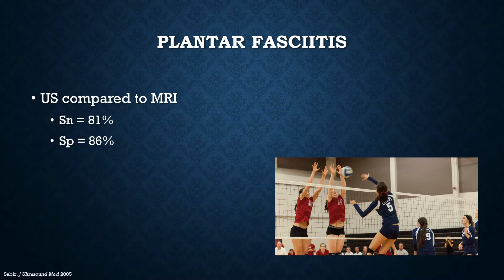Until the more recent boom of utilizing musculoskeletal ultrasound, MRI was always considered the gold standard for orthopedic imaging. Here are some diagnostic stats comparing ultrasound and MRI. Keep in mind that ultrasound has a pretty steep learning curve, so it can sometimes be difficult to obtain precise diagnostic stats for this particular imaging modality. Just take these numbers with a grain of salt, is all I'm saying.